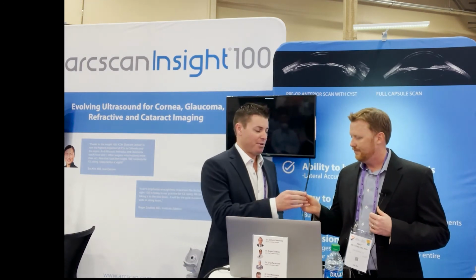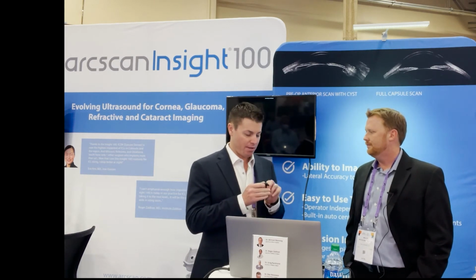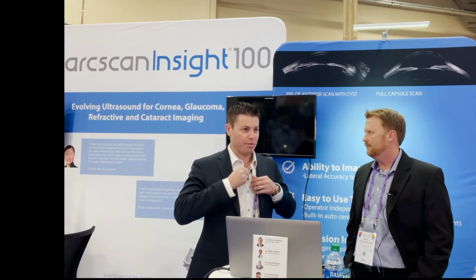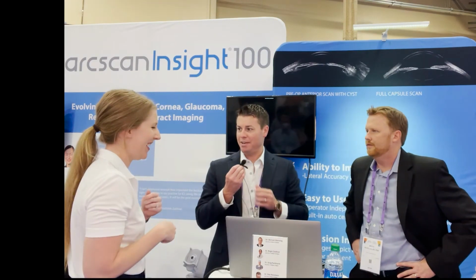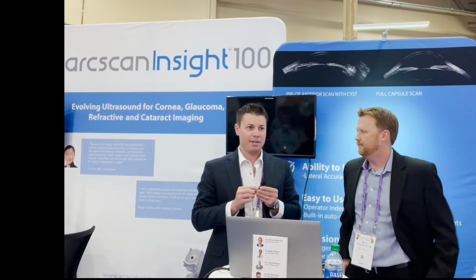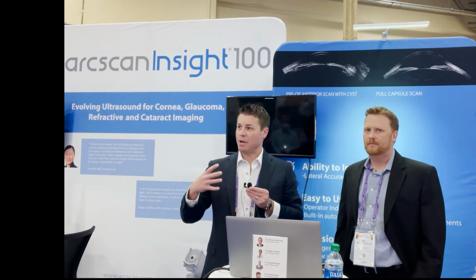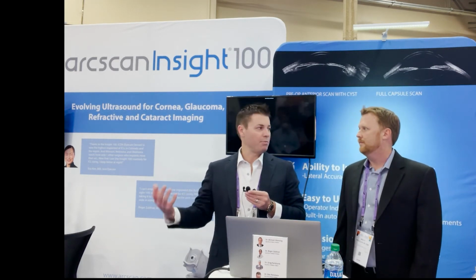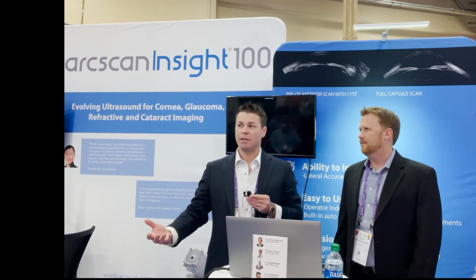Thanks, Brett. I think you really told the story of this sizing nomogram very well. And you're right. When we were using the prior UBM device, we were pretty happy. Maybe once or twice a year, we would still have an outlier, which is not fun. An outlier means you have to go back in the eye. If the lens is too small and the toric rotated, you have to do an ICL exchange for a bigger one. Or if the lens is too big and you've got a pressure crisis, that's really no fun because the patient's in pain. They may be having nausea and vomiting.